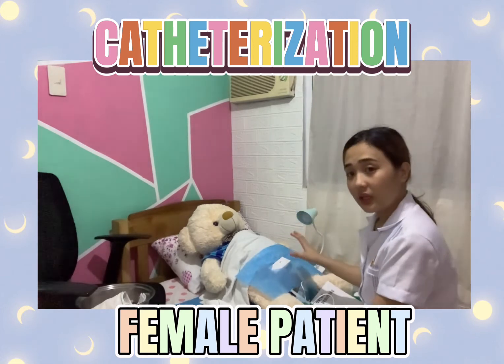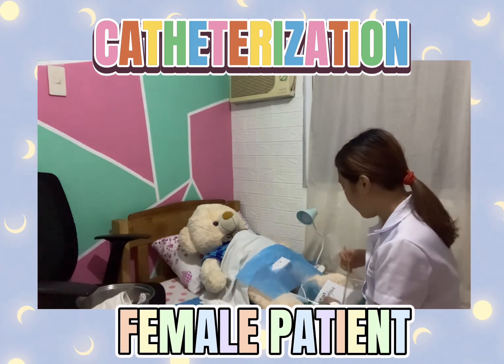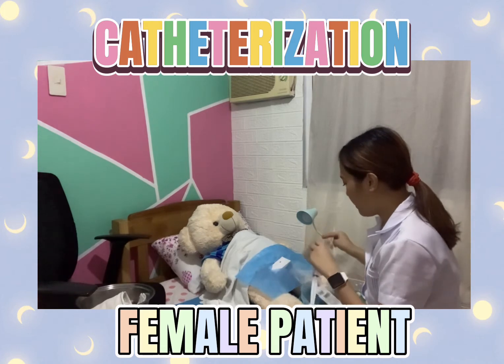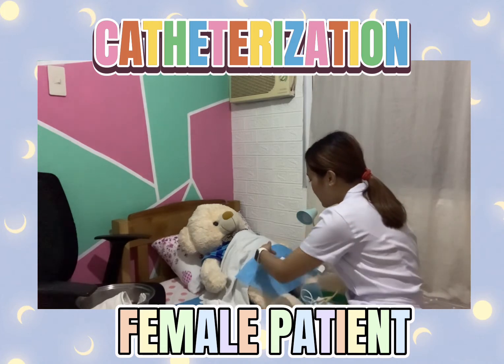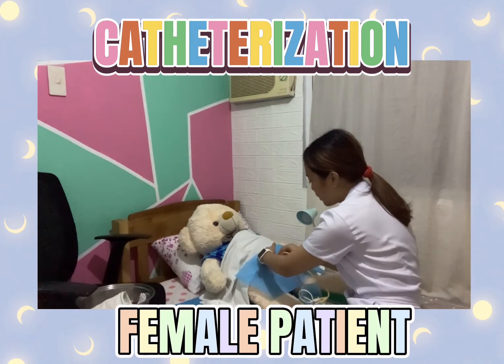After cleaning the perineal area of the patient, now is the time for us to insert the catheter onto the patient's meatus. We will separate the labia with our non-dominant hand, and we will insert the catheter onto our patient's meatus.